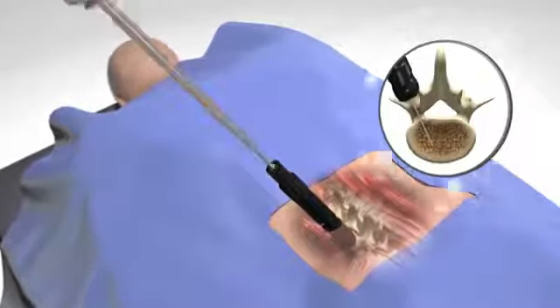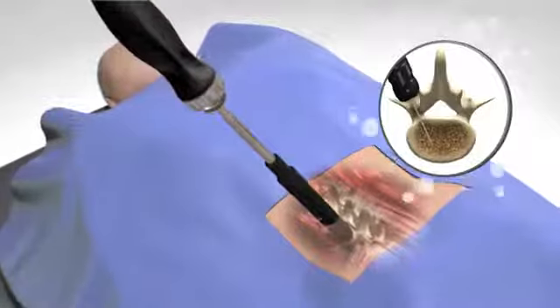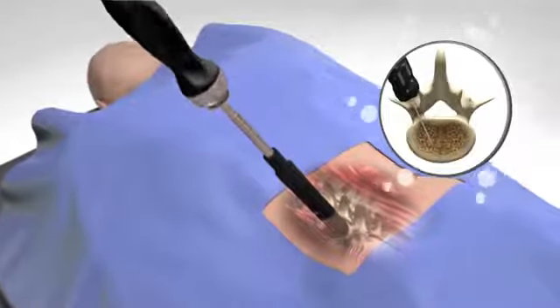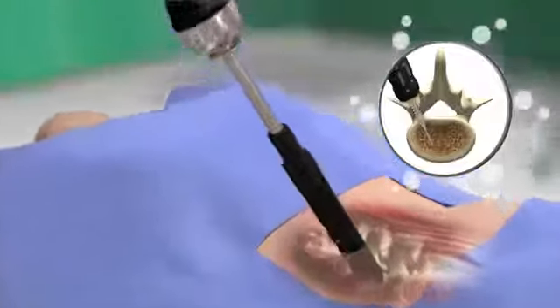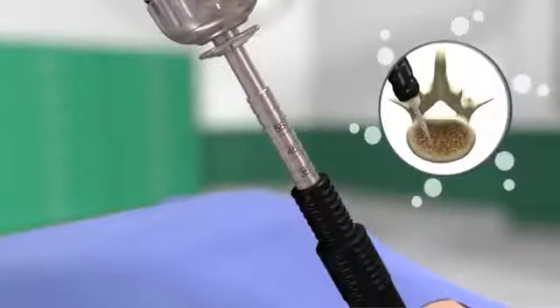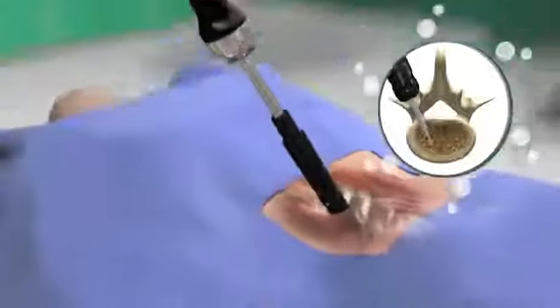Tapping the pedicle can now take place if desired. The advancement of the tap will occur through dilator three. Approximate screw length can be determined by looking at the screw length indicator at the proximal end of the cap.